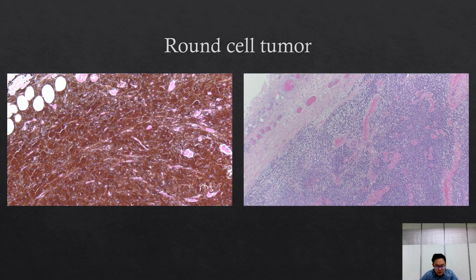Additionally, another really common tumor we see is the mast cell tumor. In the low power field, you can see all these little cells organized in a loose, disorganized sheet, and lots of eosinophils around it. The mast cell tumor cells release factors that cause vasodilation and predispose the site to bleeding. So often, when we see these biopsies from mast cell tumors, there's a lot of blood in the tumor and a lot of edema, tissue swelling.